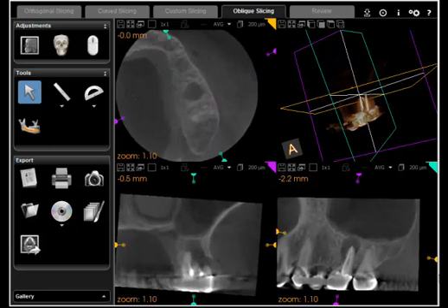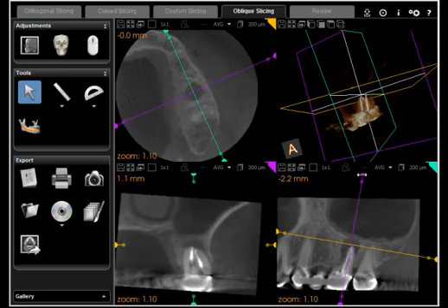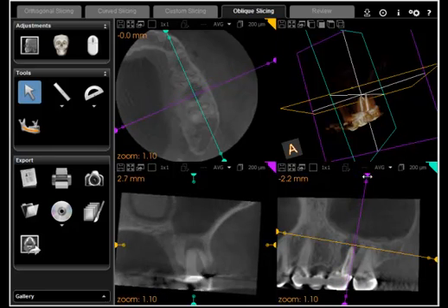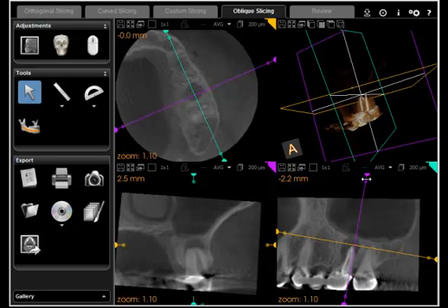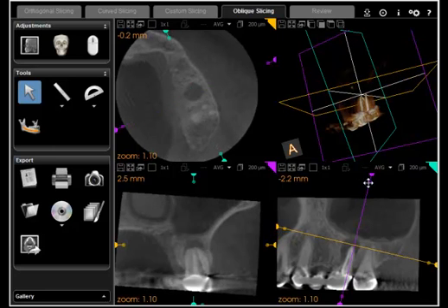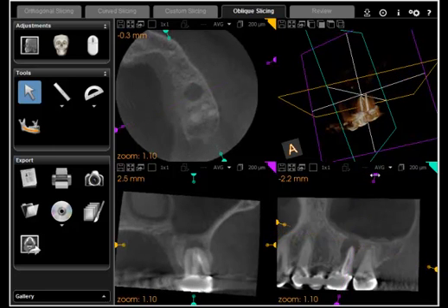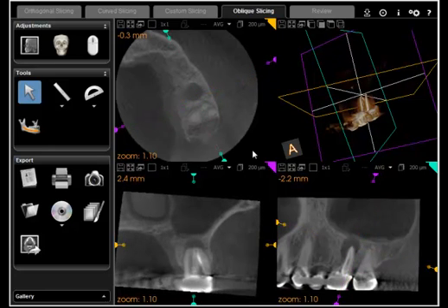If we're worried about this fused distal buccal root, you can move the position back and forth, and then also change the angle of that slice, so now you can better visualize it.